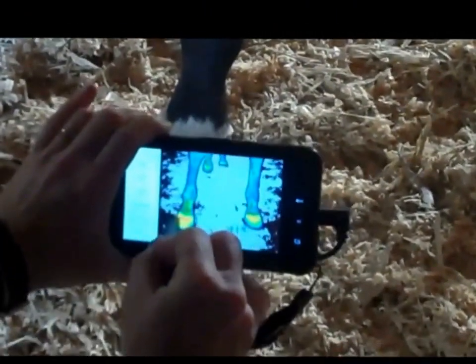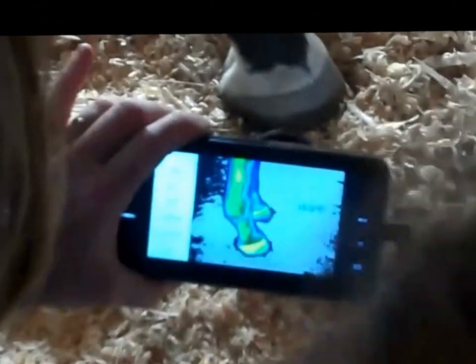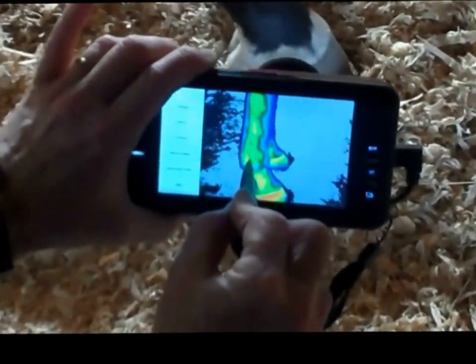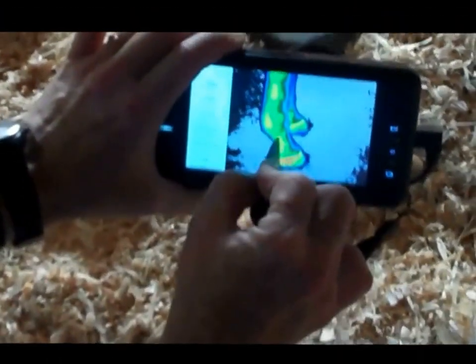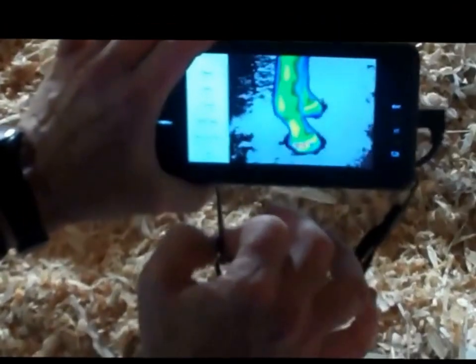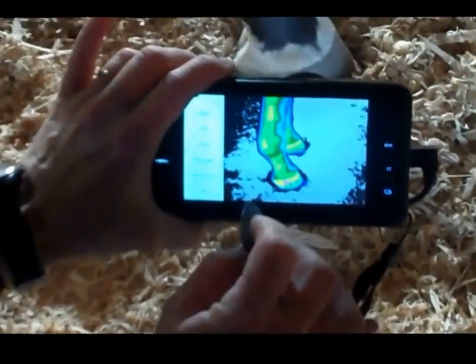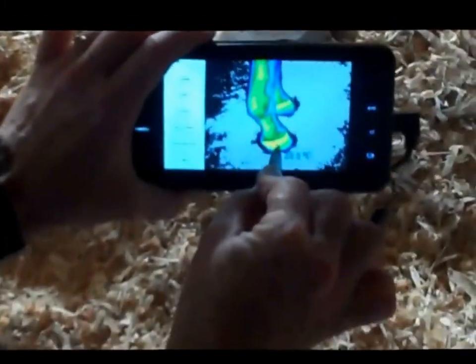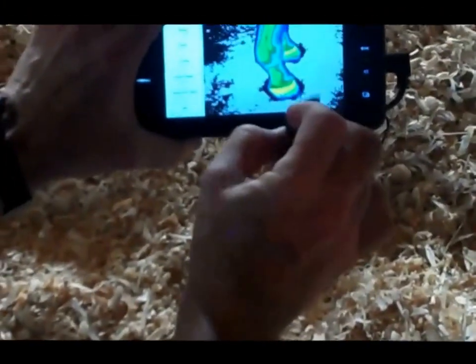There's more colour coming up through his legs. We can see the foot is warm, but we can also see there's extra heat in this fetlock and through all these areas here. That could be an indication that the shoeing needs changing. I can also put my little pointer right on the area and find the exact temperature. If we just move back and look at his body, the legs are always colder than the body.